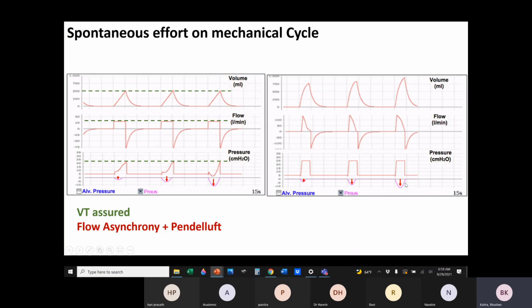So the total negative pressure or total pressure gradient has increased. As the total pressure gradient increases, you can see the difference between this and this is higher than here, than here. The result of that is that more and more tidal volume gets in. All right. What is the benefit? The patient is comfortable because the patient needs more flow, and the patient is getting more flow, and getting more tidal volume. But if it is not suitable for the patient, then it may cause an overinflation injury.